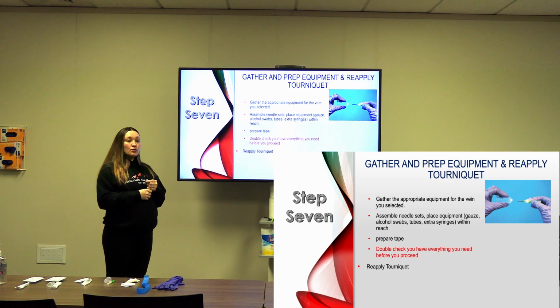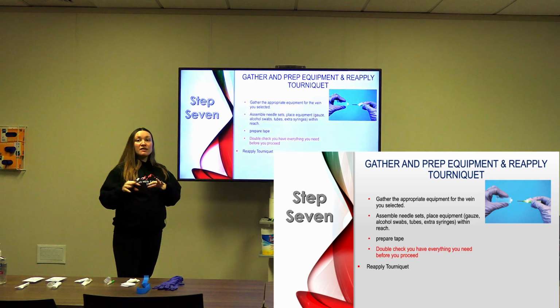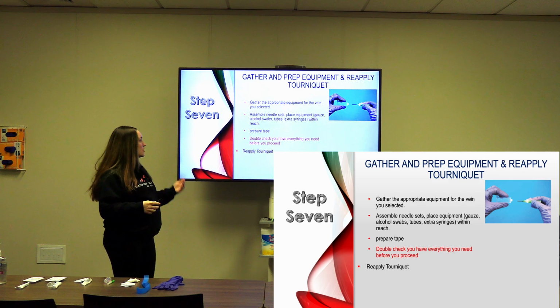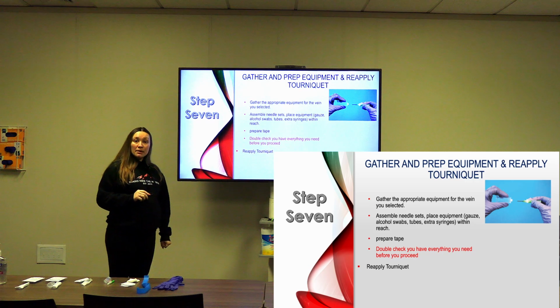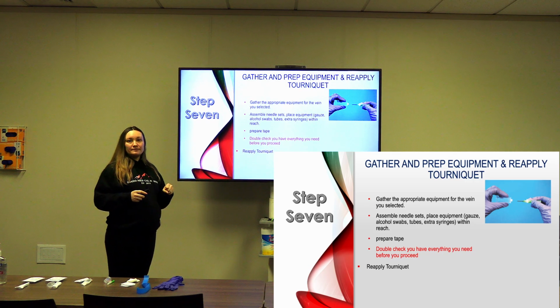I always go through and I double check everything I've brought. So I look and I say, okay, I have gauze, I have alcohol, I have tape, I have my needle set, I have my tubes. Okay, so prepare everything you need, get it set up in front of you for easy access, and then you can continue. Once you've set everything up, you've double checked everything, you can then reapply your tourniquet. Okay?